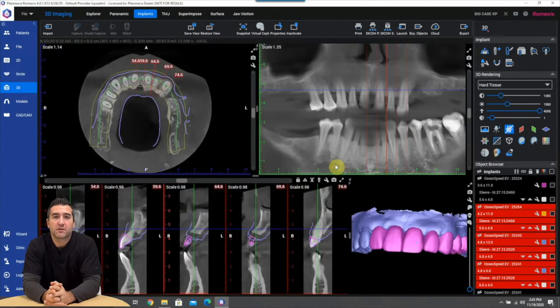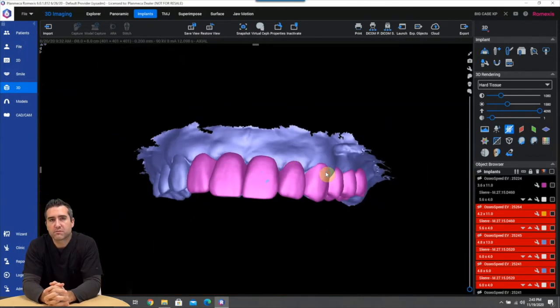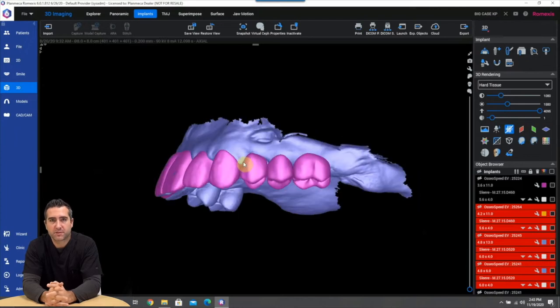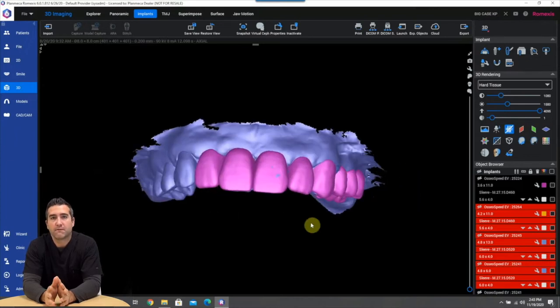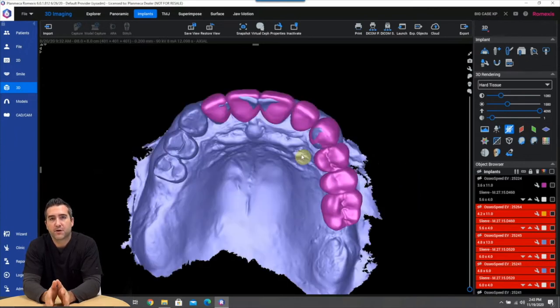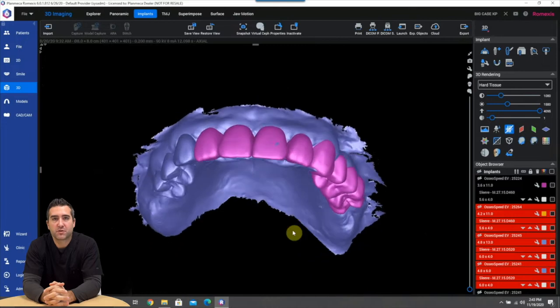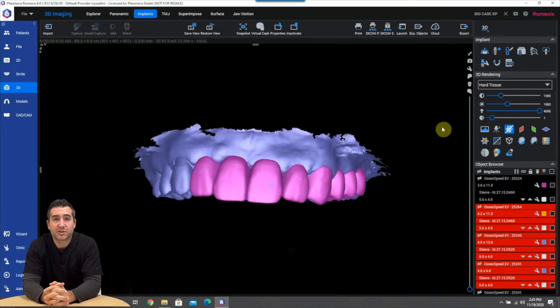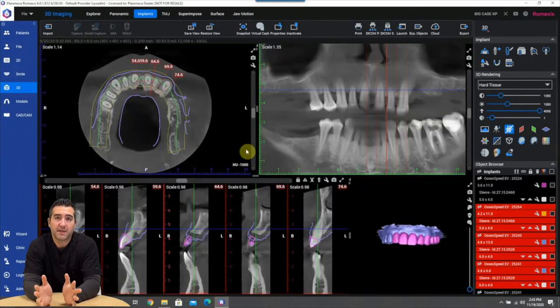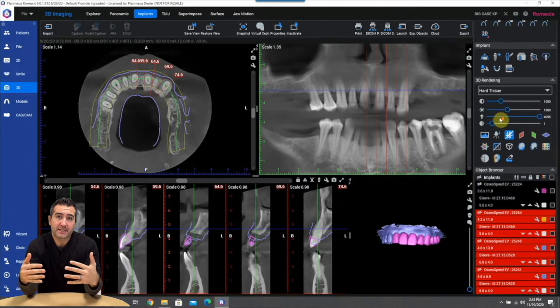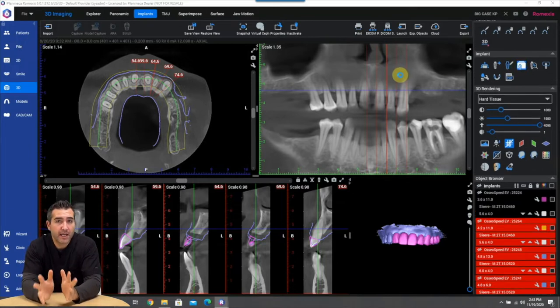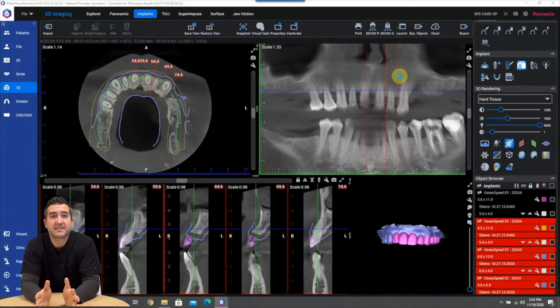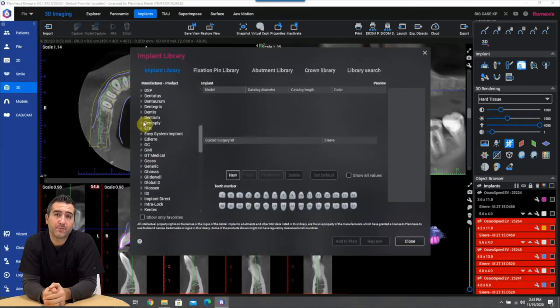So the next thing is we're going to bring in our wax up and what's cool is Romexis remembers the orientation of that from PlanCAD Premium export so there's no merging that needs to occur. It's just a click of a button and you can see we perfectly have that wax up instantly merged in with the intraoral scan, everything's pinned together to the DICOM data set and now we're ready to pick our implants.